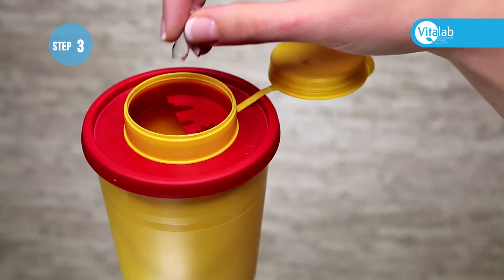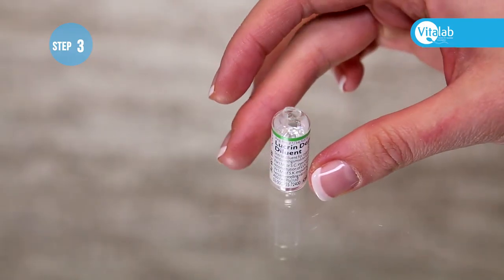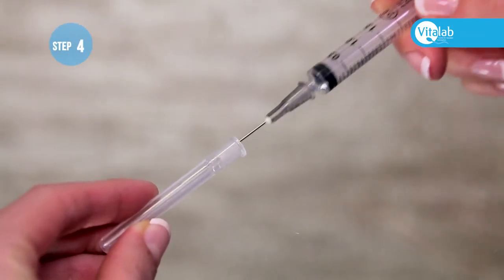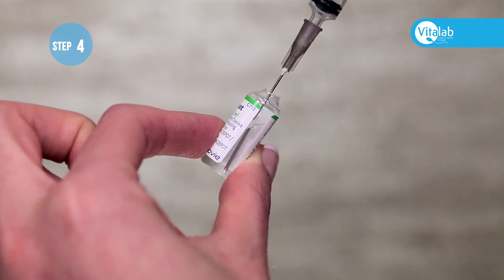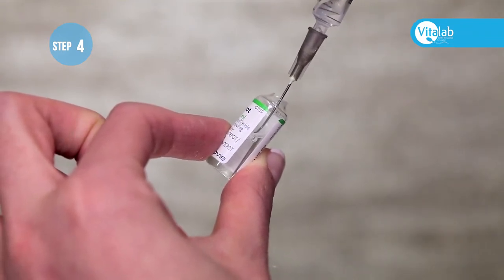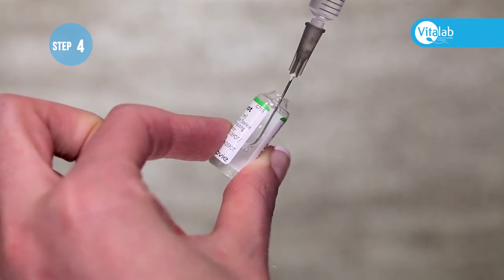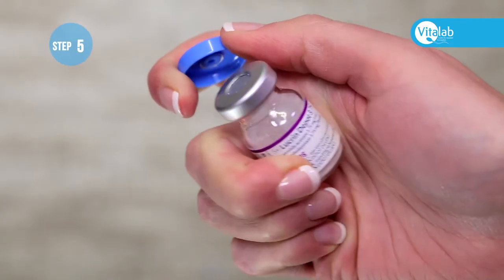Discard the top part into the sharps container. Place the ampoule on a flat surface, remove the plastic cap from the needle, and put the needle in the bottom corner of the water ampoule at a slight angle with the bevel side to the bottom. Draw up the water into the syringe, then remove the blue cap from the vial.